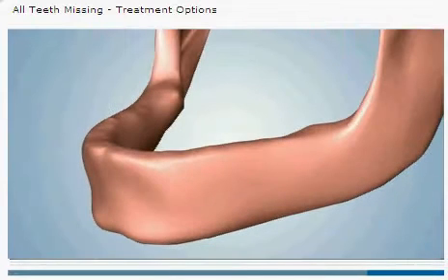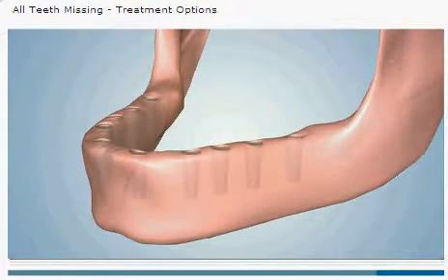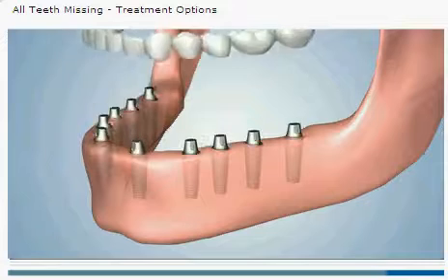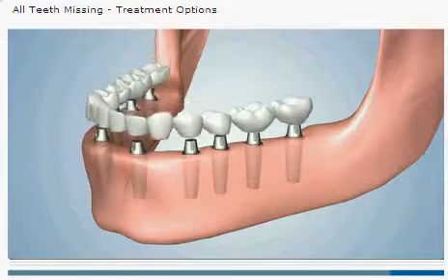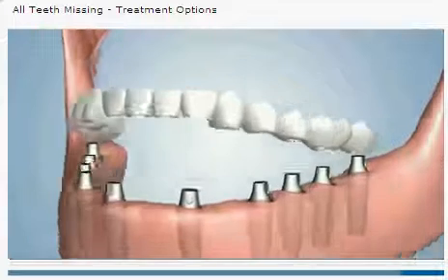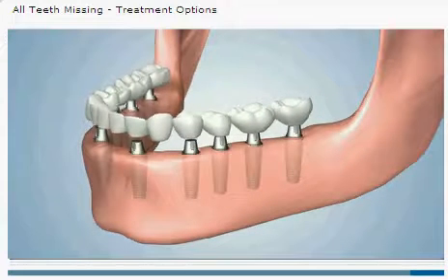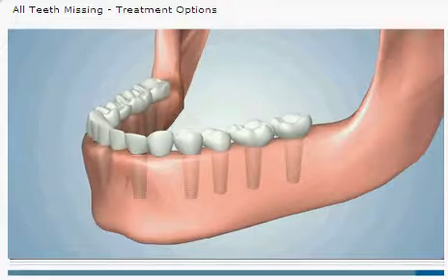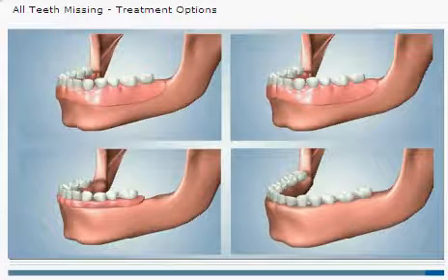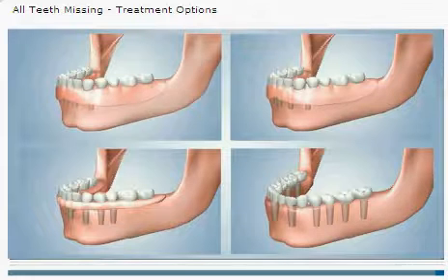A fourth option, known as a fixed implant bridge, commonly involves the placement of eight, ten, or twelve dental implants. Standard abutments are attached to the implants to prepare for the placement of the crowns. The crowns are then cemented to the implants as one piece. This option most closely resembles the look and feel of natural teeth while virtually eliminating bone loss. Dental implants will provide you with a stable and long-term solution that reduces the pain, discomfort, instability, and bone loss that denture patients experience.